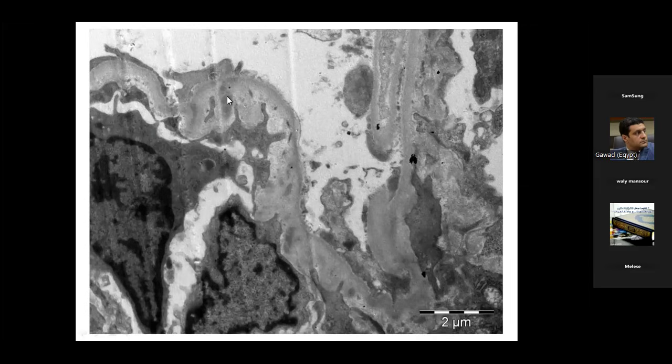So that's this picture. We see immune complex deposition disease. This is a new basement membrane material that is laid on.